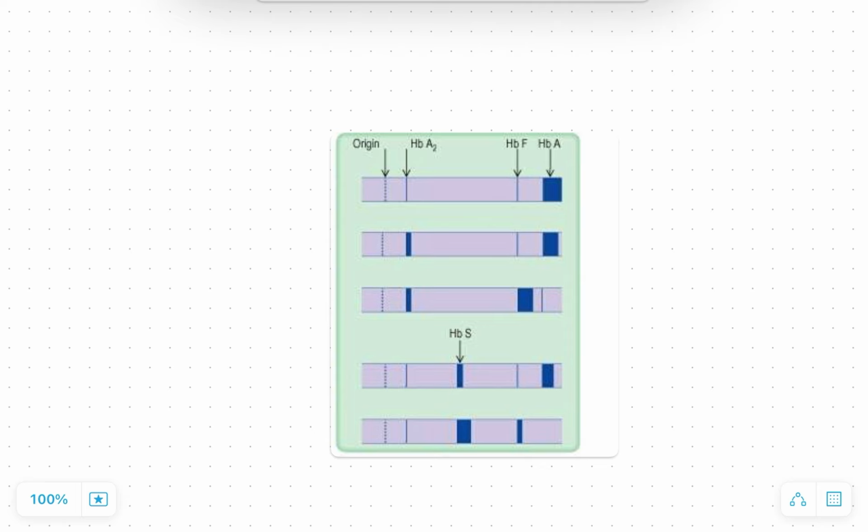So let us solve a clinical MCQ based on this. In the first patient, the order we see is HbA, HbF, and next HbS and HbA2 or HbC. So the normal order is present, HbA is predominant, so this is a normal adult.